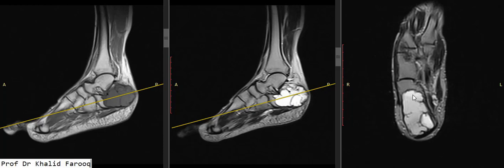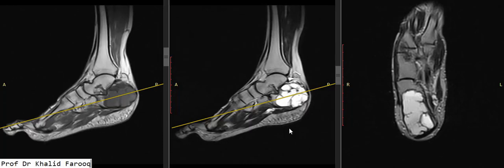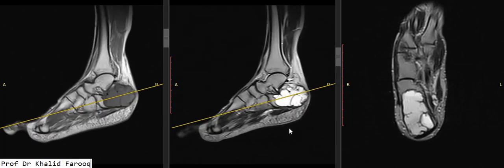There is mild fluid-fluid level suggesting a hemorrhagic component in it, favoring the possibility of aneurysmal bone cyst. Our differential would be with giant cell tumor, because we can see that it is subarticular in location as well. There is expansion of the posterior aspect of the bone.